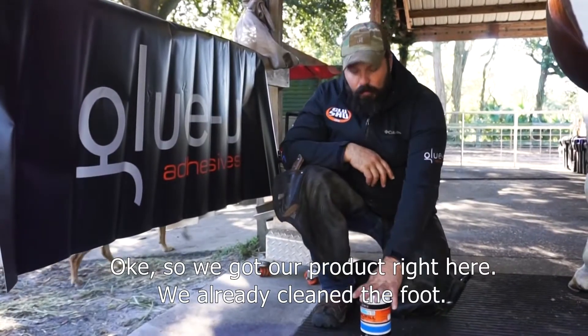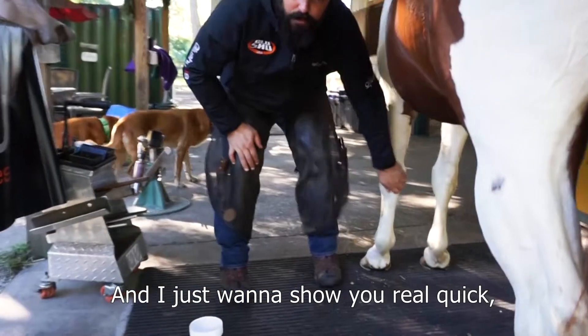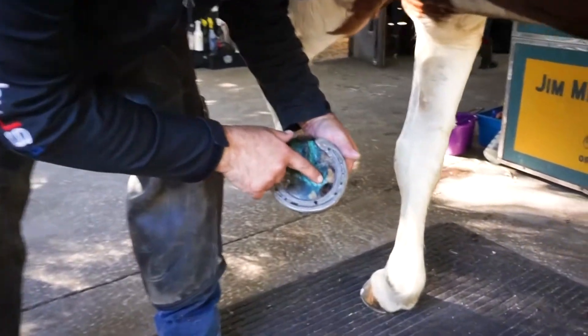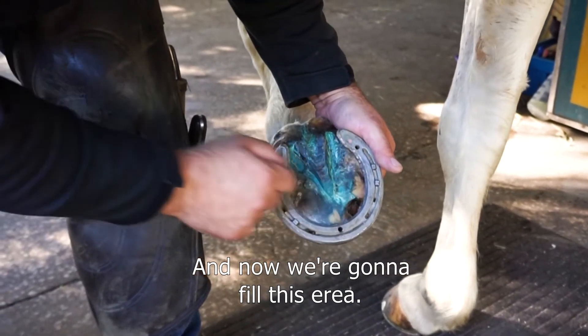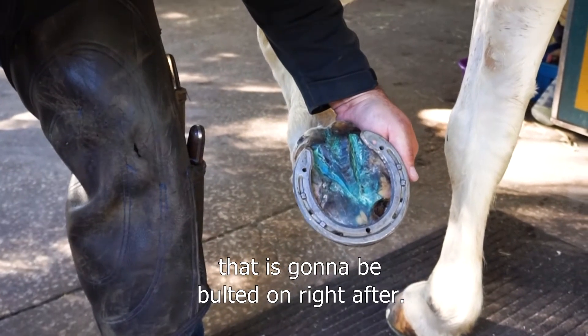We've got our product right here, we already cleaned the foot, and I just want to show you real quick what we're talking about. We had some copper sulfate packed and you can see where the surgery was done. Now we're going to fill this area and give him support underneath the hospital plate that is going to be bolted on right after.